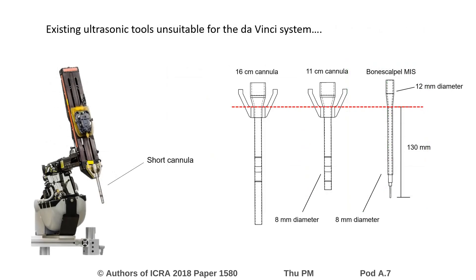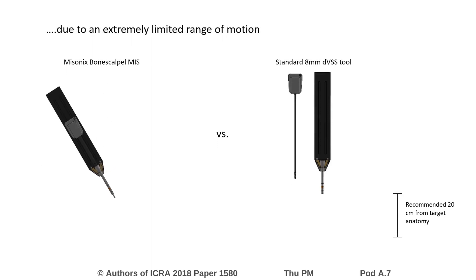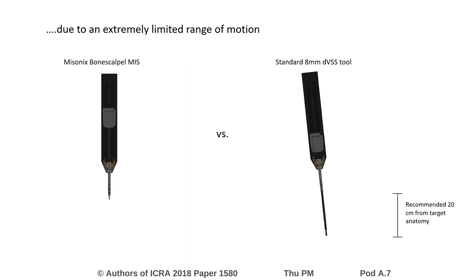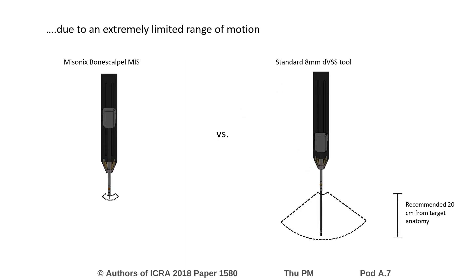Existing ultrasonic tools were investigated to determine if they could be easily adapted to the da Vinci robotic system. This animation shows the resulting range of motion if the longest existing ultrasonic tool were to be placed on the da Vinci system. On the left, it can be seen that the tool only extends past the remote center of motion by a few millimeters, effectively resulting in no range of motion compared to the standard da Vinci tool on the right. Based on geometry, it was determined that existing tools are not suitable.